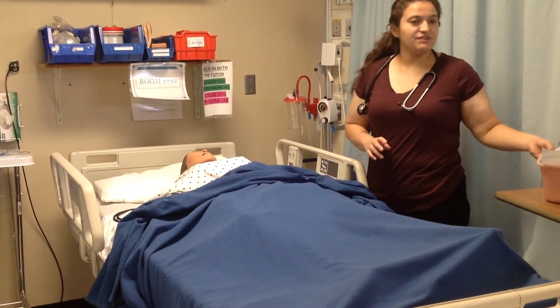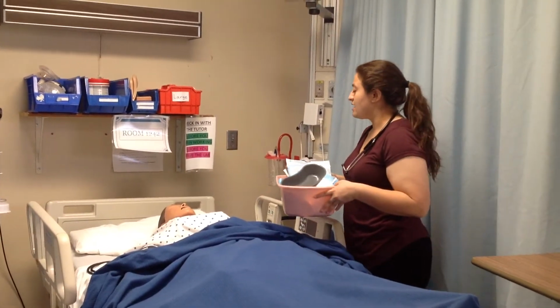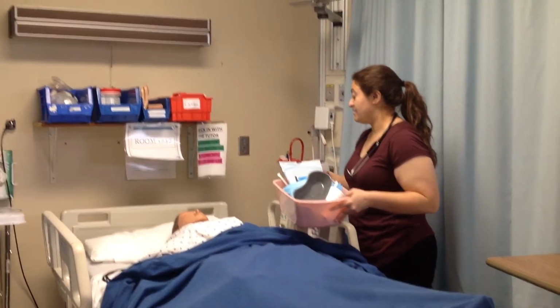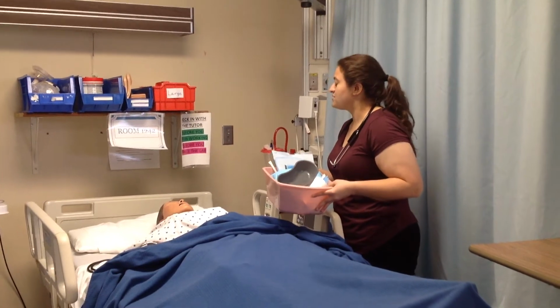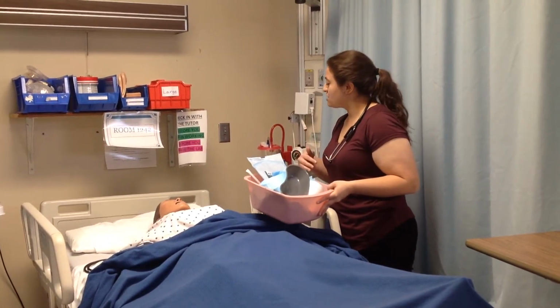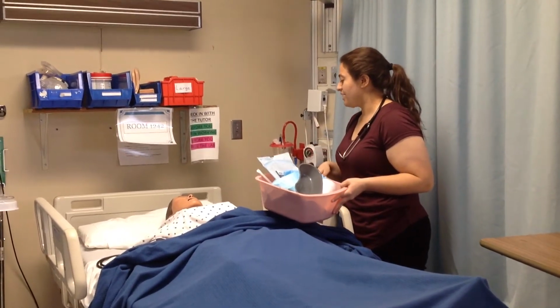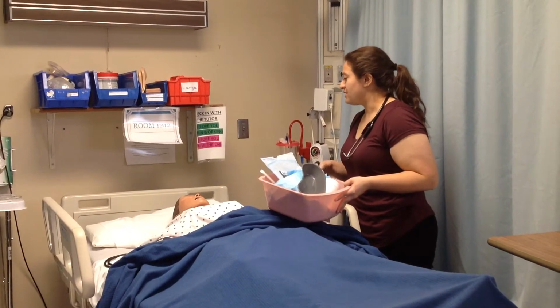So first things first, I would go ahead and explain to the patient the procedure that I'm going to do. So sir, I'm just going to be doing an insertion of an NG tube, and I'm also going to be doing some suctioning. The NG tube is supposed to help relieve any nausea and the vomiting as well. Hopefully it'll help with that, and just make you feel better.